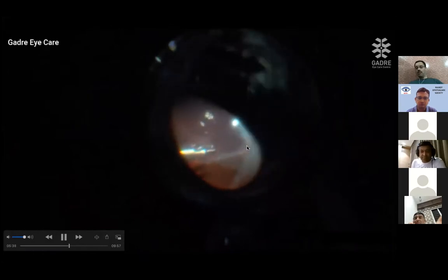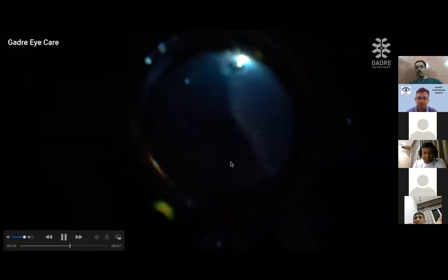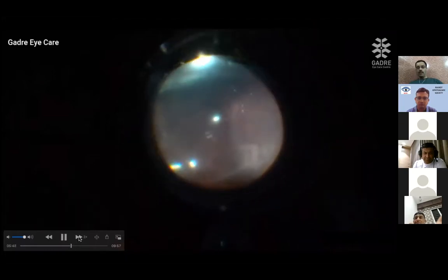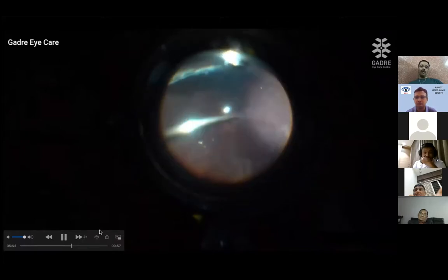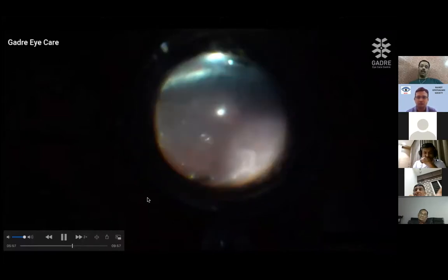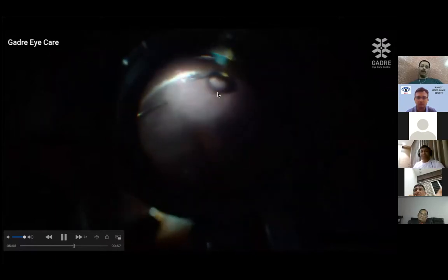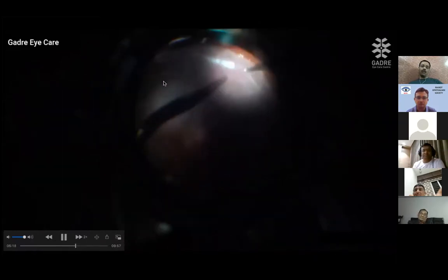With the help of PFCL, the posterior retina was tamponaded, and it helped me in removing this large bit of membrane in toto. On further injection, the inferior part, as you see, is still standing up in spite of PFCL, suggesting that there is some intrinsic retinal contraction happening inferiorly, and a retinectomy would have to be done inferiorly. So I proceeded with the cautery marking inferiorly.